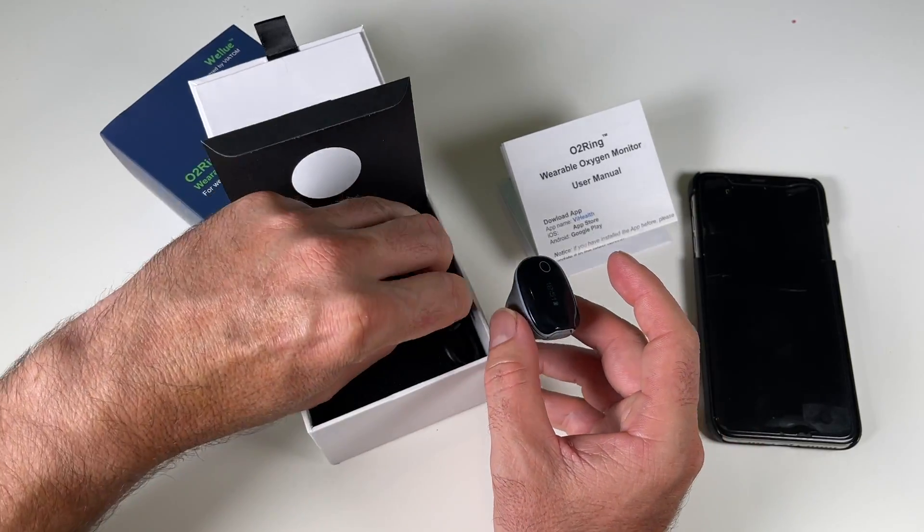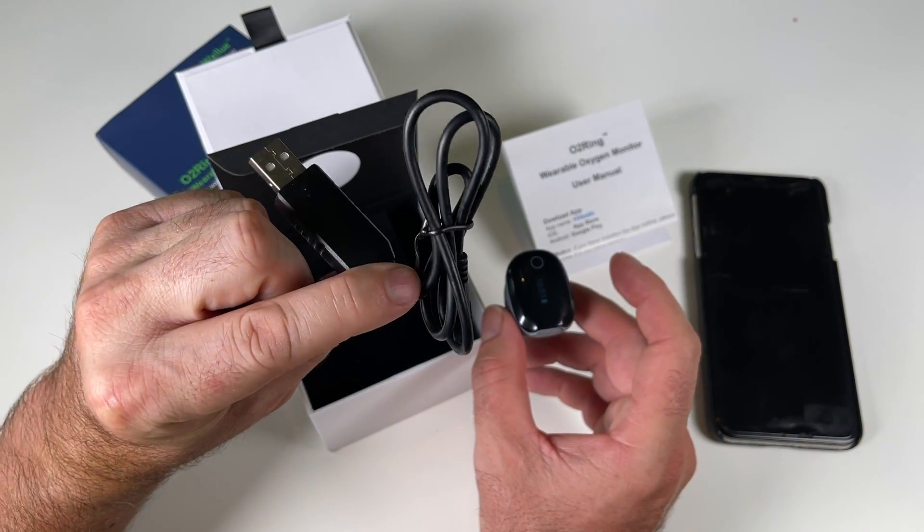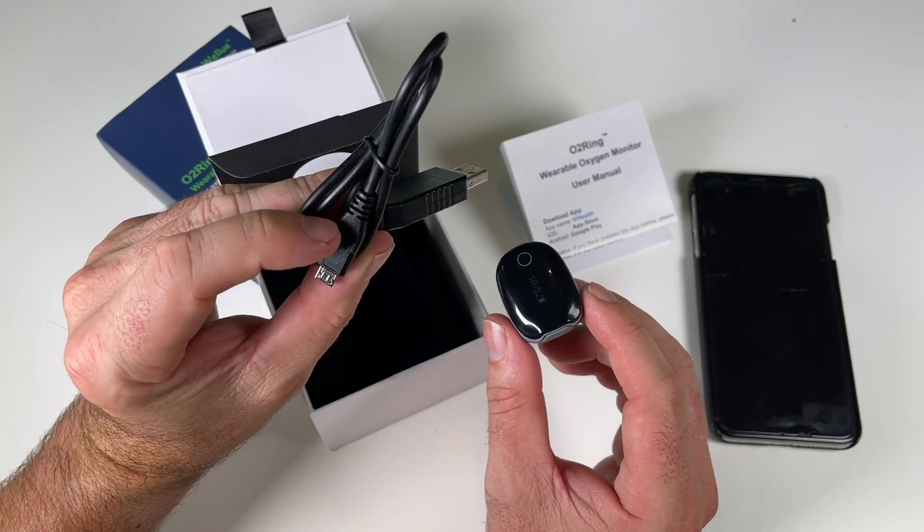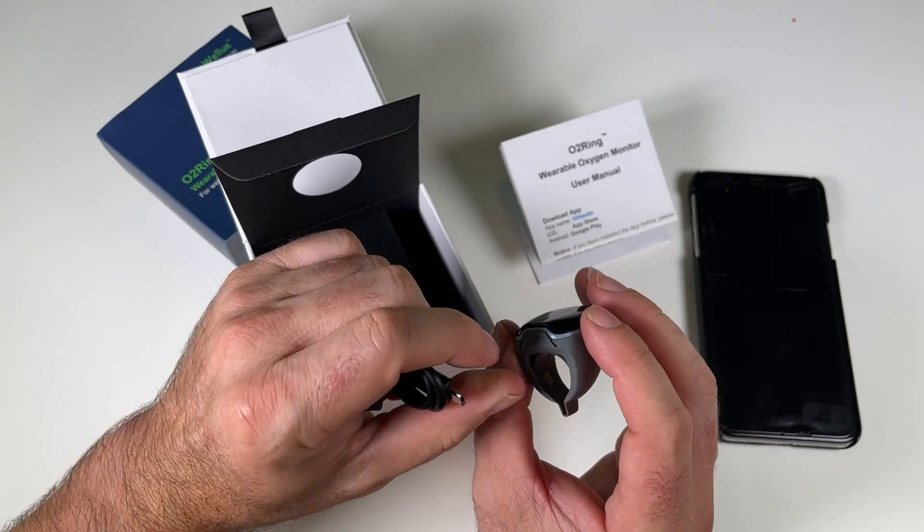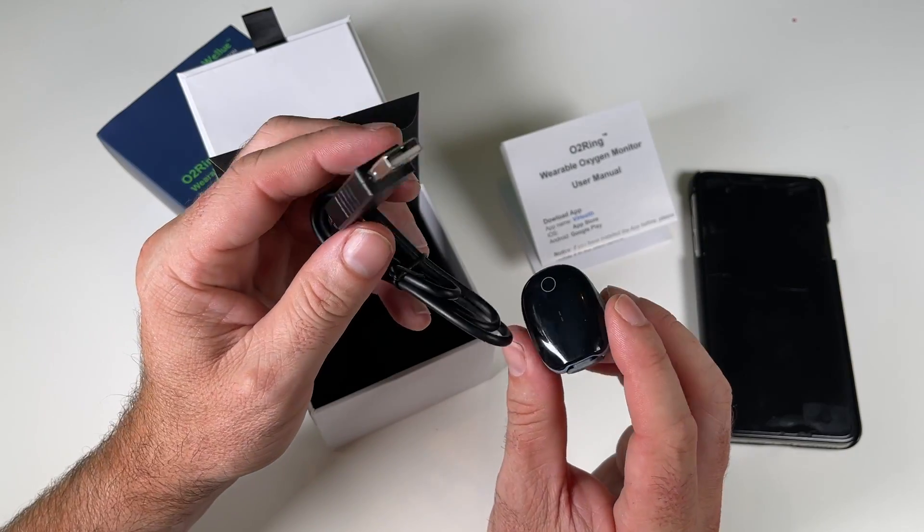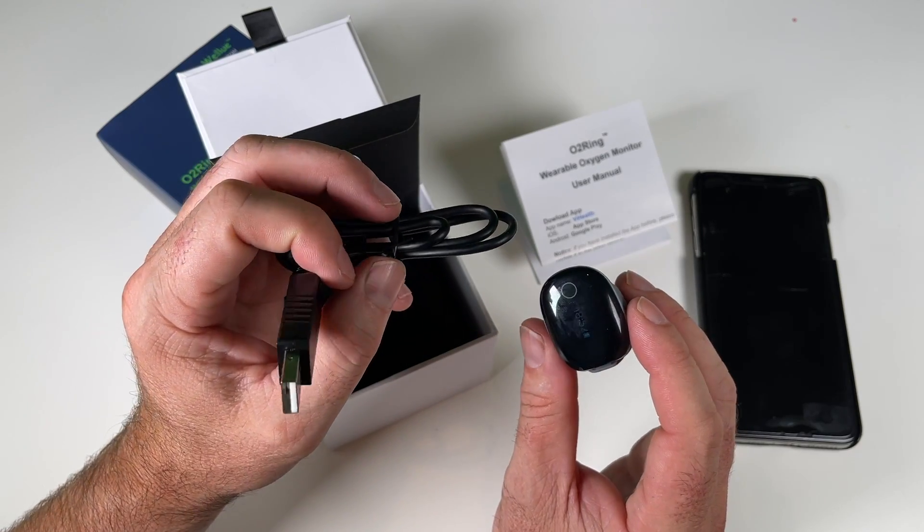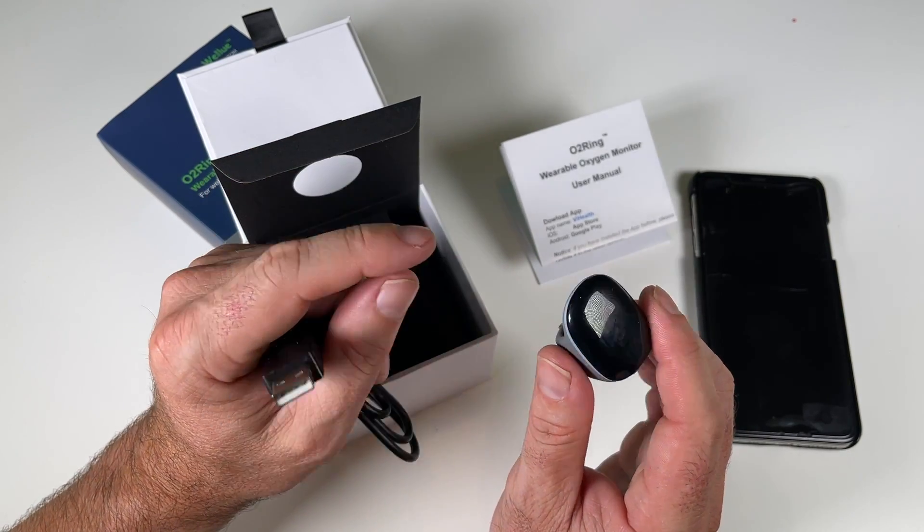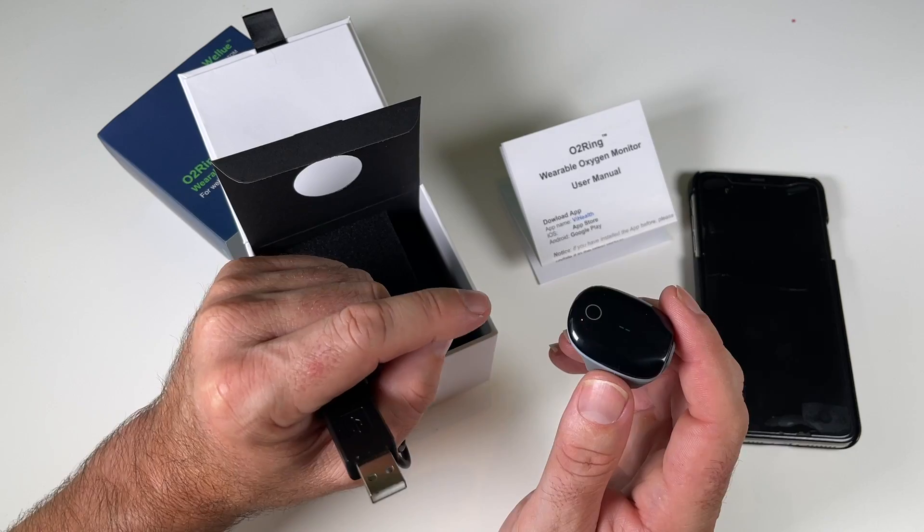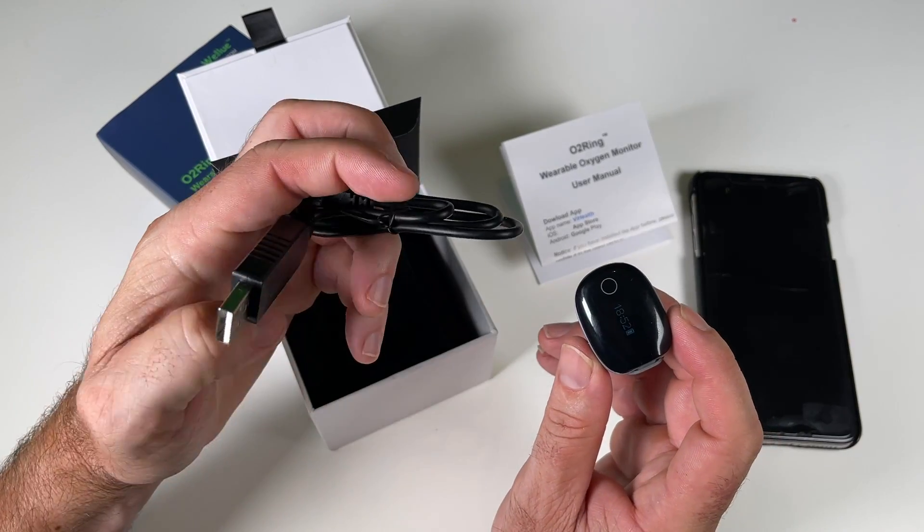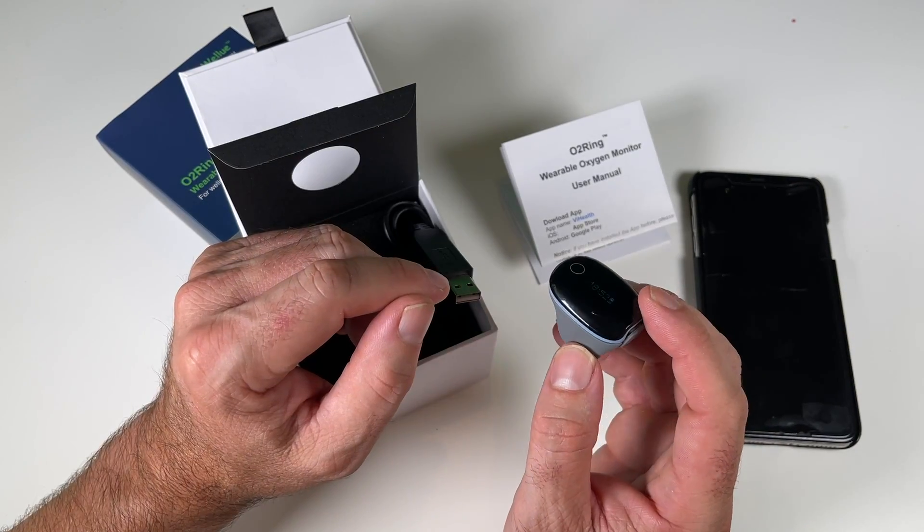And then you've also got a USB charging cable. So when you first get it, plug it into the computer and you just plug the charger in the back here. It charges up over a couple of hours and then it's good to go. So there's no real on or off switch with it. When you put it on your finger, it turns on. And when you take it off your finger, it turns off.